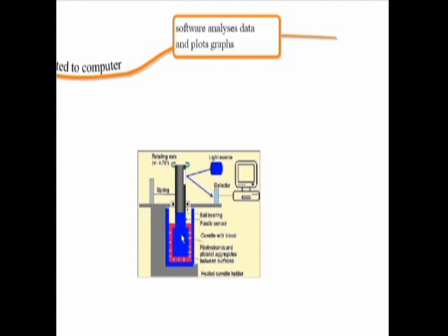In the meantime, this little cup is being heated as well. So as it spins and moves on its axis, these little clots start forming, and this detector here sees, oh, it's starting to clot, and starts recording on the graph when the clot starts forming.